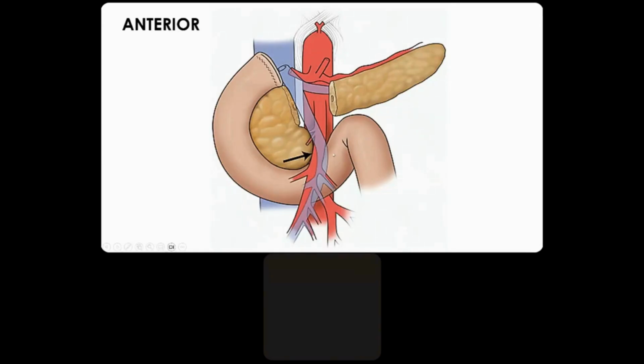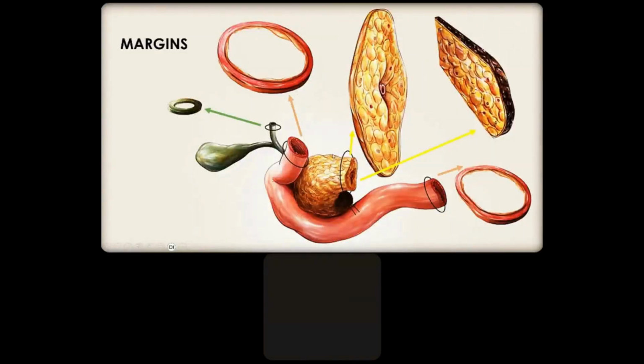And if the biliary gallbladder is included, then the biliary margin is important. So here it is. You've got the duodenal loop that has been taken out with the head of the pancreas, so the proximal and distal margins will be important. This is assuming now you've got the specimen and they have not done frozen sections at the time of the operation.